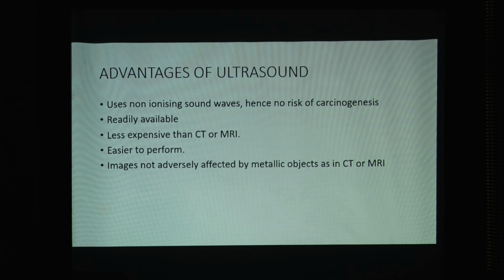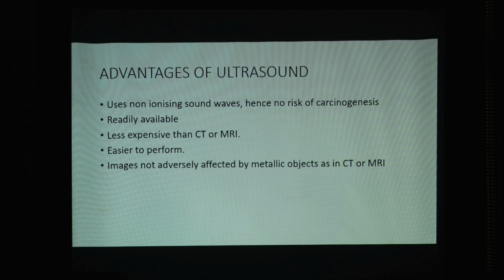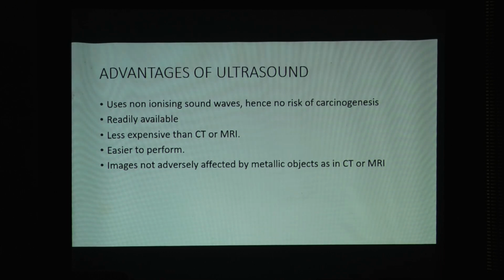Advantages of ultrasound: because it uses non-ionizing sound waves, it has no recorded risk of carcinogenesis, etc. It is readily available, less expensive than CT or MRI, easier to perform. Images are not adversely affected by metallic objects, as in CT and MR.